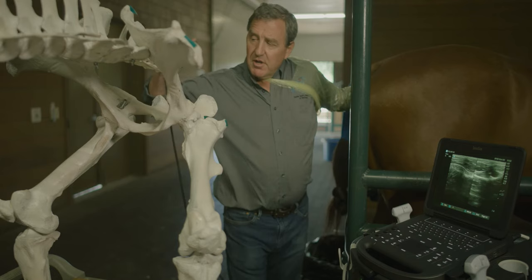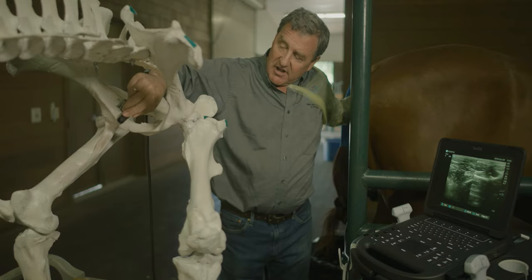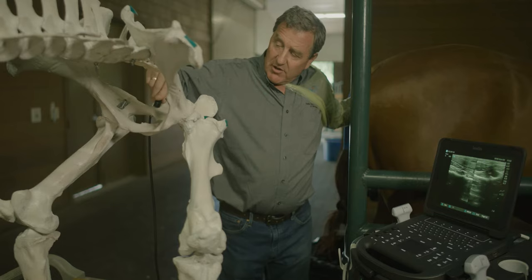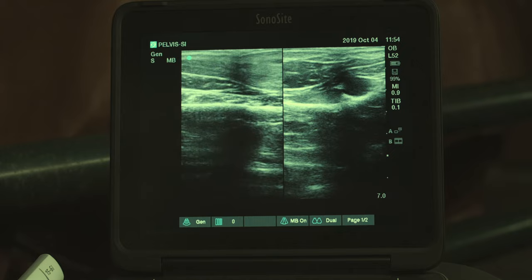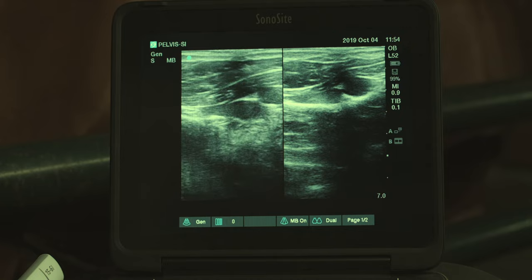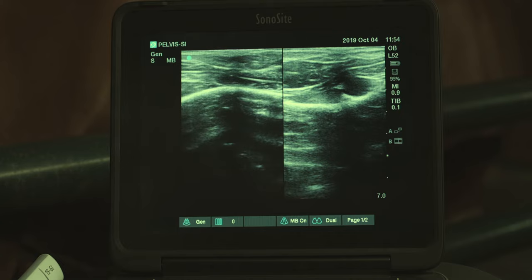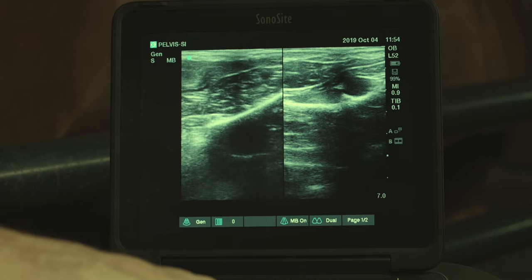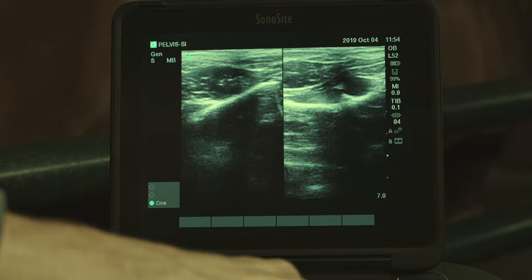From this portion we're going to move forward to the pubic bone. On our pelvic specimen, you're on the acetabulum — all you need to do is slide your hand down. It allows you to see from the acetabulum simply sweeping down to the pubic bone, which is at the cranial edge of the obturator foramen. On the image, we go from acetabulum and just sweep down to get the pubic bone. Pubic bone shape is going to vary from horse to horse.